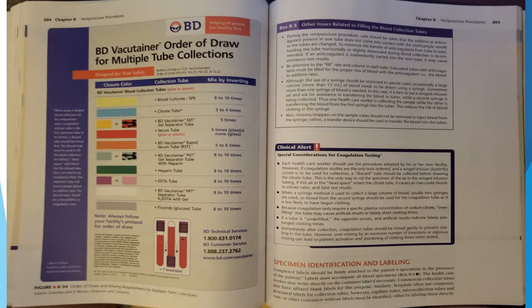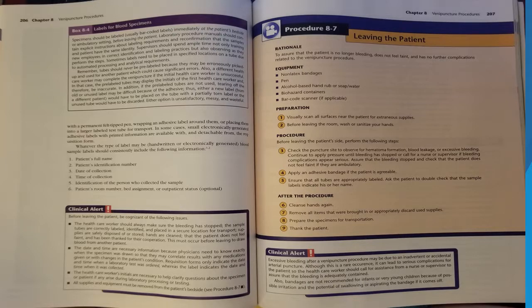However, capillary tubes, micro-collection tubes, and vials or other containers without labels must be identified either by labeling them directly with a permanent felt-tip pen, wrapping an adhesive label around them, or placing them into a larger labeled test tube for transport. In some cases, small electronically generated adhesive labels with printed information are available, detachable from the requisition form.